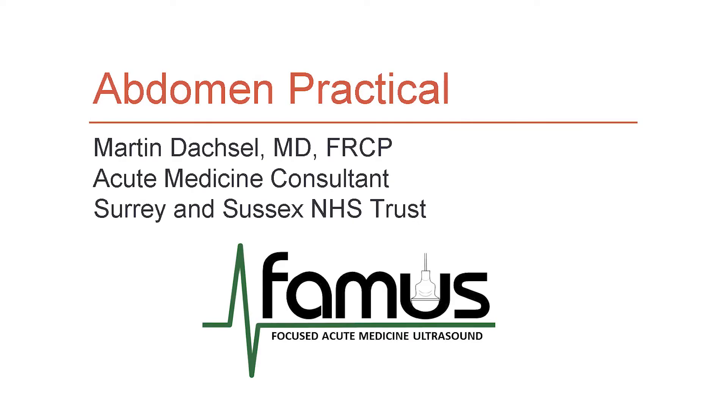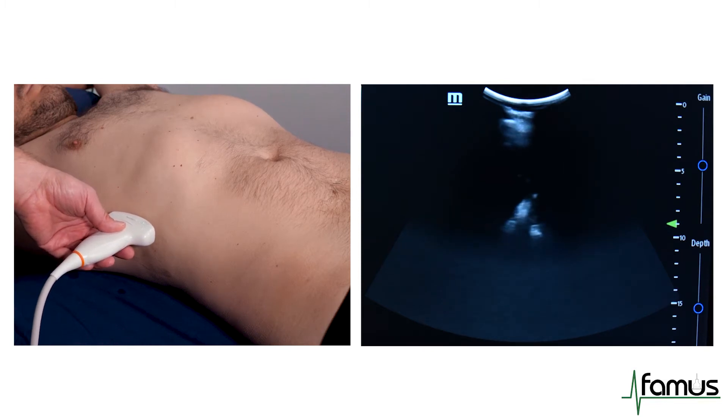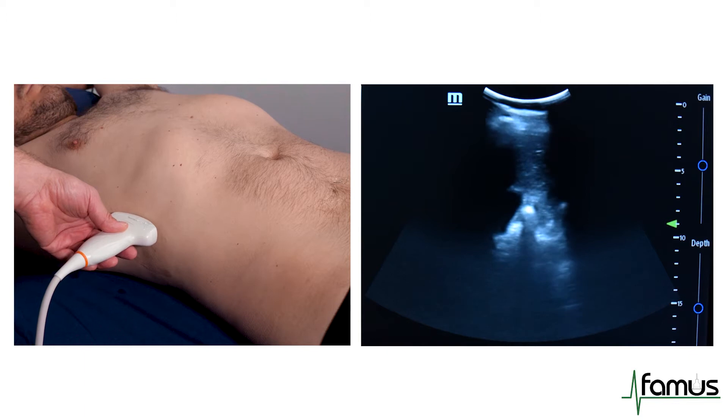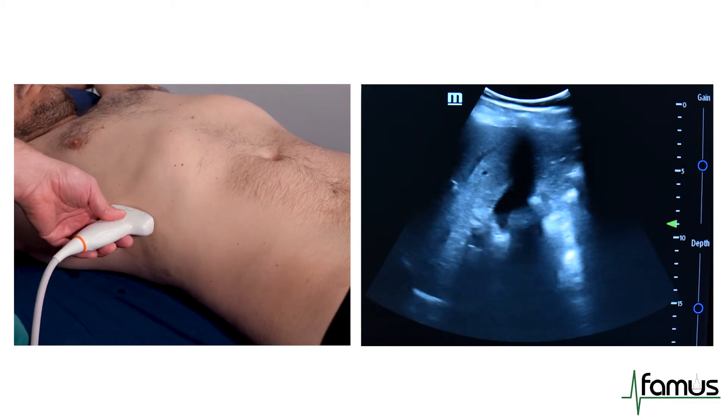We will use a curvilinear probe for this scan. This is the abdominal session, starting in the right upper quadrant with the probe in a longitudinal plane, with the marker dot towards the head. I would start in the mid-axillary line.